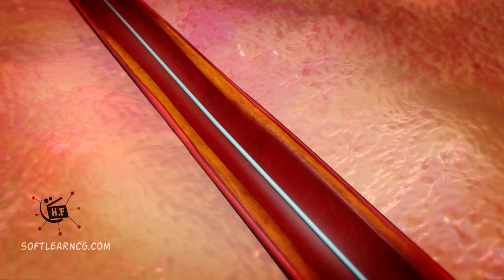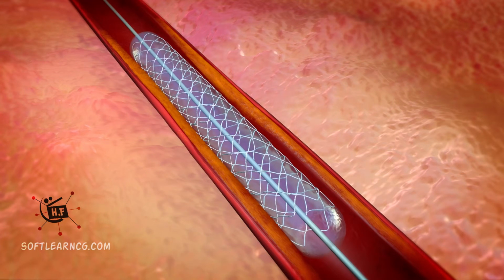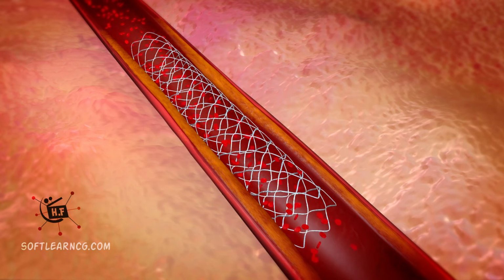Many times, a second balloon-tipped catheter is inserted, but this one is encircled with a metal stent. When this balloon is expanded, the stent also expands and its mesh-like structure locks permanently to the wall of the artery, providing support and preventing plaque from building up again, thus improving blood flow to the heart.